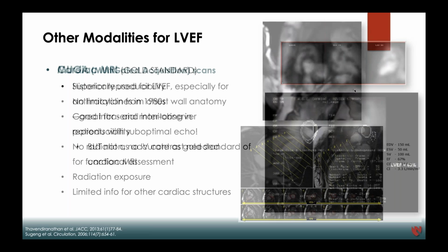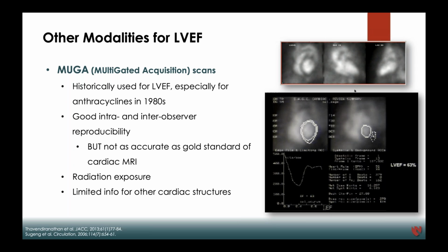Yep. Historically they even did prospective studies back in the 90s to show that LVEF by MUGA was better than echo. And I know those studies were done, and I think it probably is a more effective EF assessment than echo. But your example right here is beautiful.